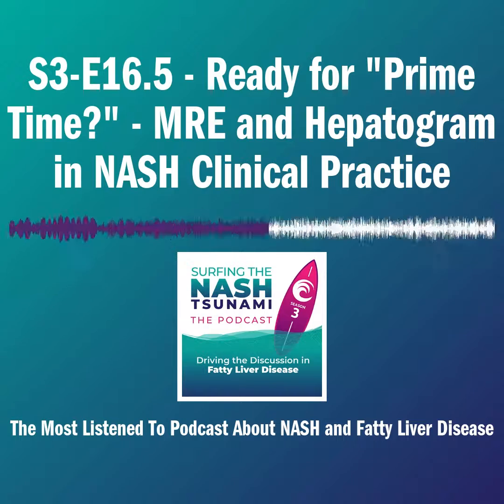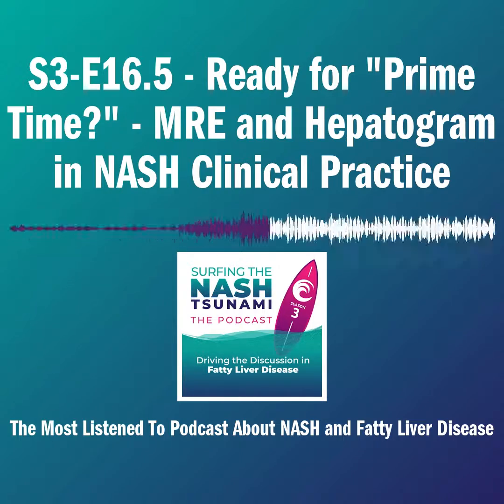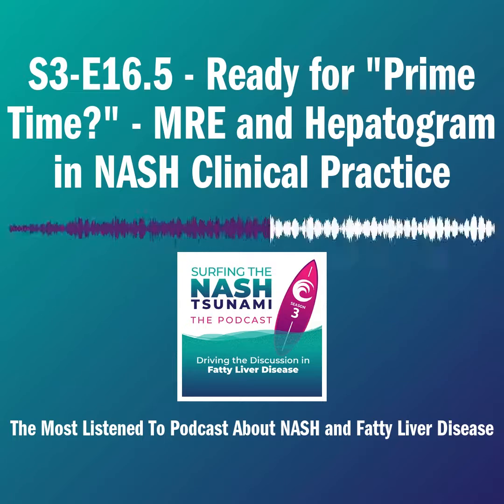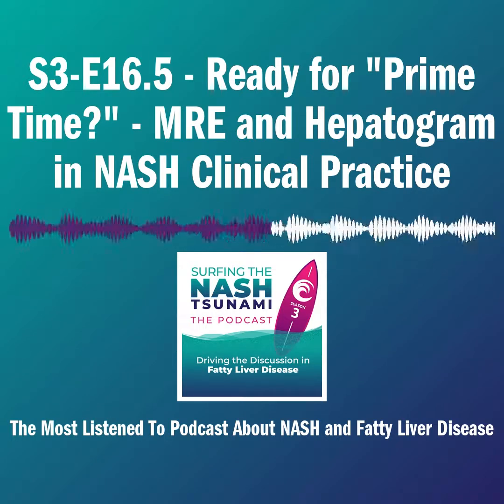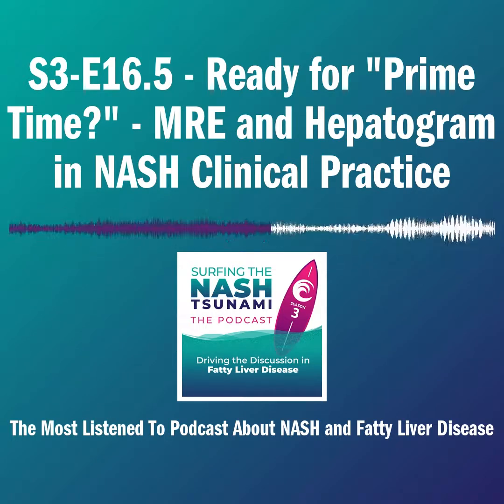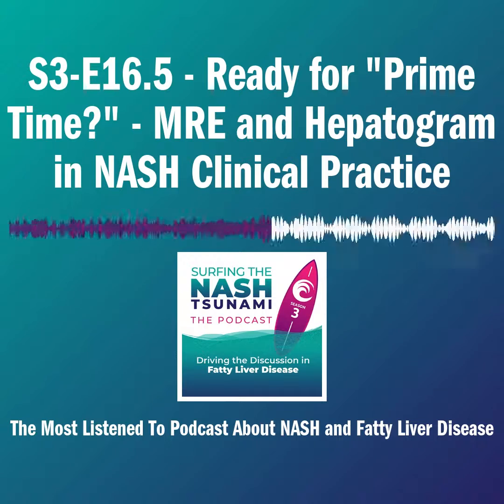So let me turn that around one more time to you, Kay, because I think this is where MRE actually has the upper hand on liver biopsy. I think it is much better at holistically telling me what's going on within all the different segments of the liver. Right? We know that fibrosis is heterogeneous, and so I think MRE is better.